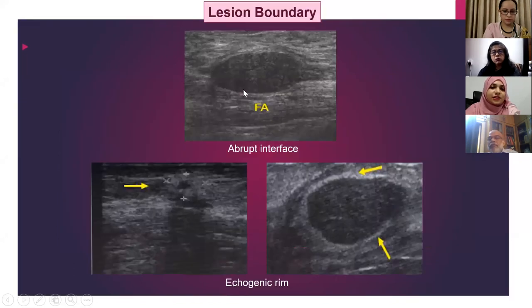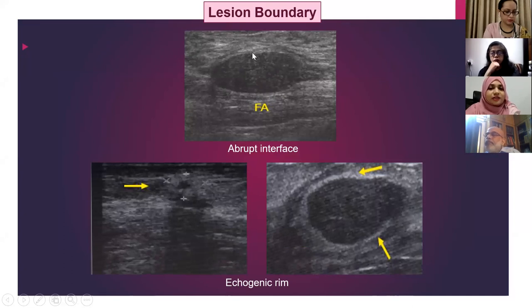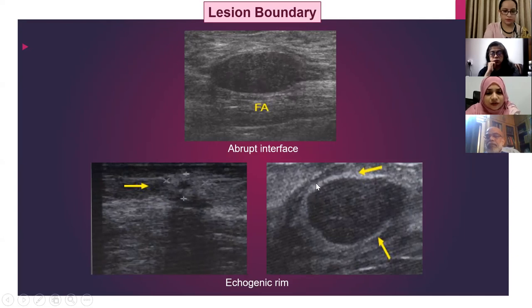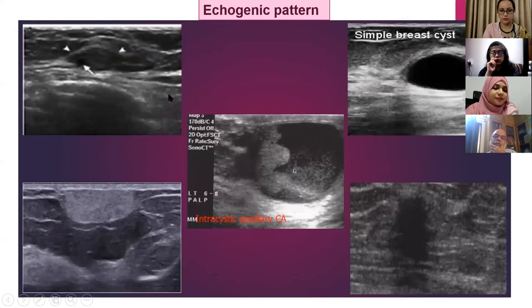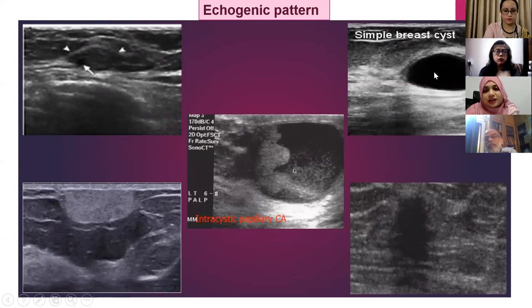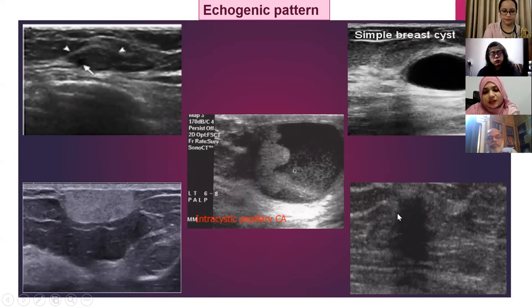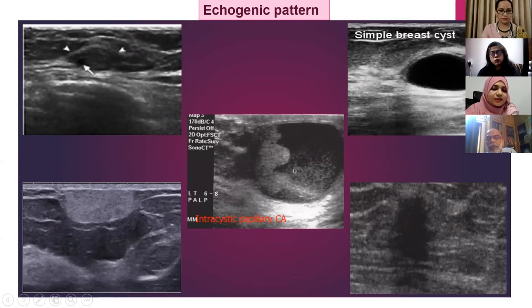Regarding lesion boundary: there can be an abrupt interface between the lesion and the surrounding breast parenchyma with no transitional zone, or there can be an echogenic rim — thin or thick — surrounding the lesion. The echogenic pattern can be isoechoic, which can be very difficult to see, anechoic like a simple cyst, echogenic like a lipoma, hypoechoic, or mixed echogenic having both solid and cystic components.